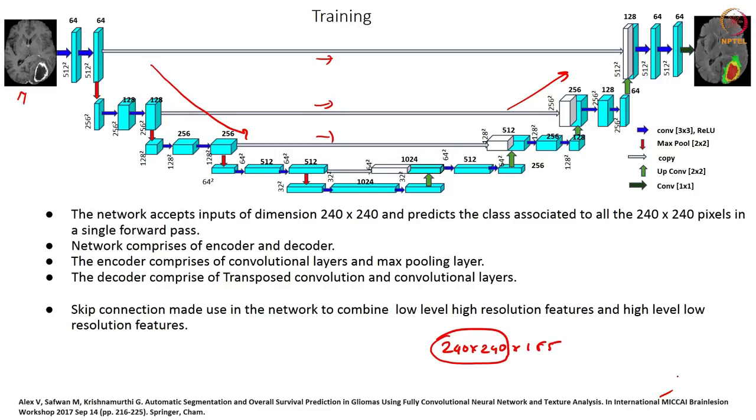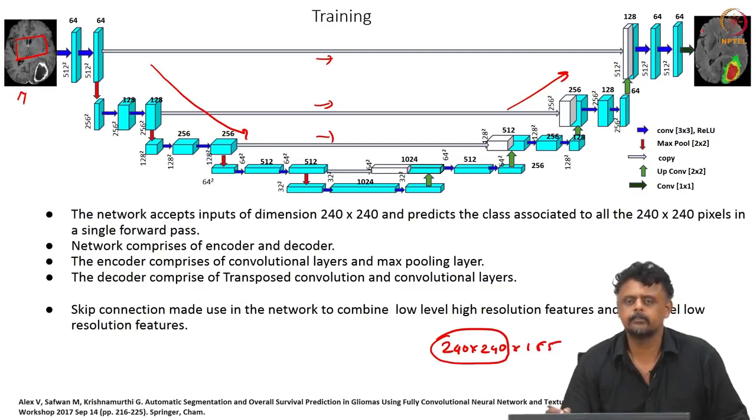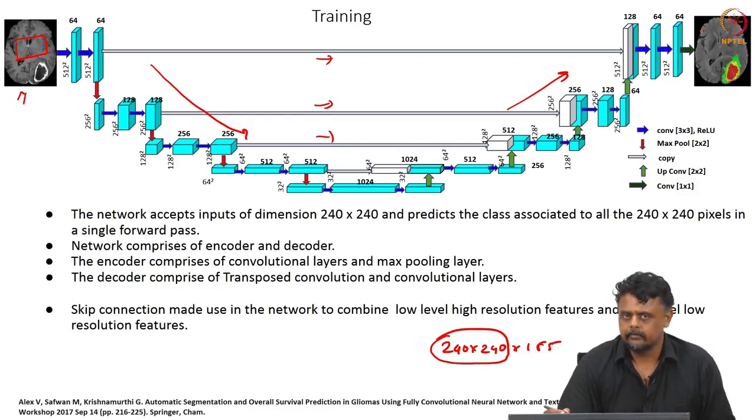The better method would have been to predict a smaller area within the network, because as you see, there is not enough information. There are two problems here. If you noticed, we have mentioned earlier, the images are 3D. These are not 2-dimensional images, these are 3-dimensional images, and it is more meaningful to process them as such.